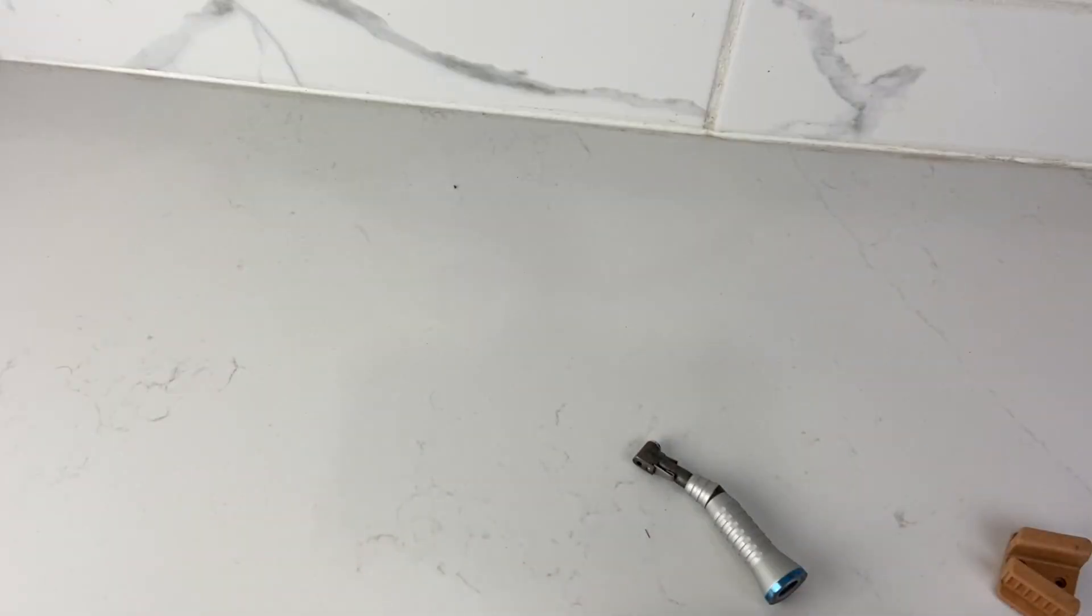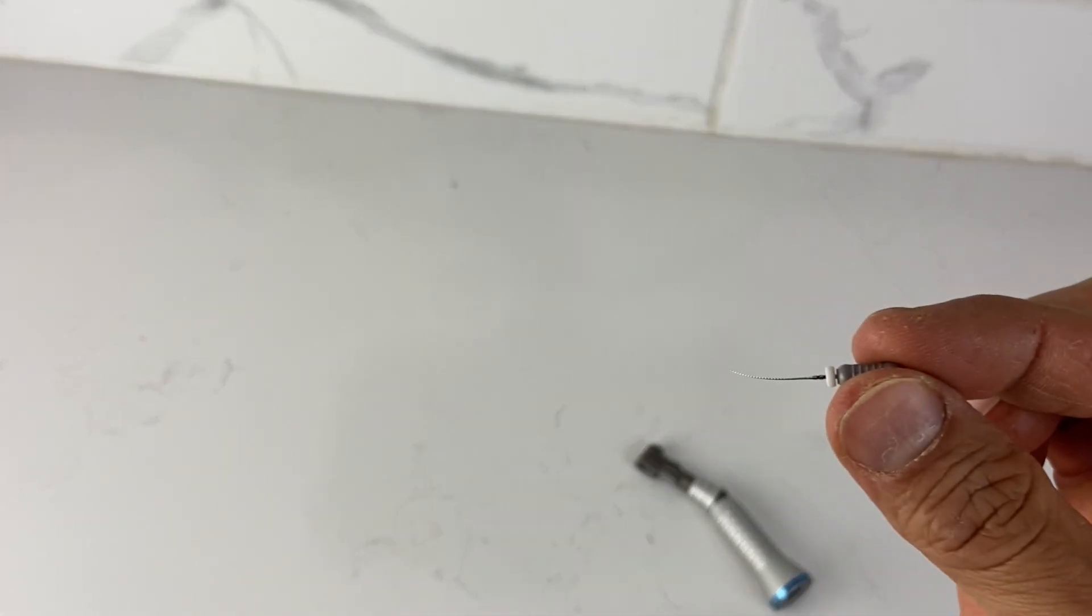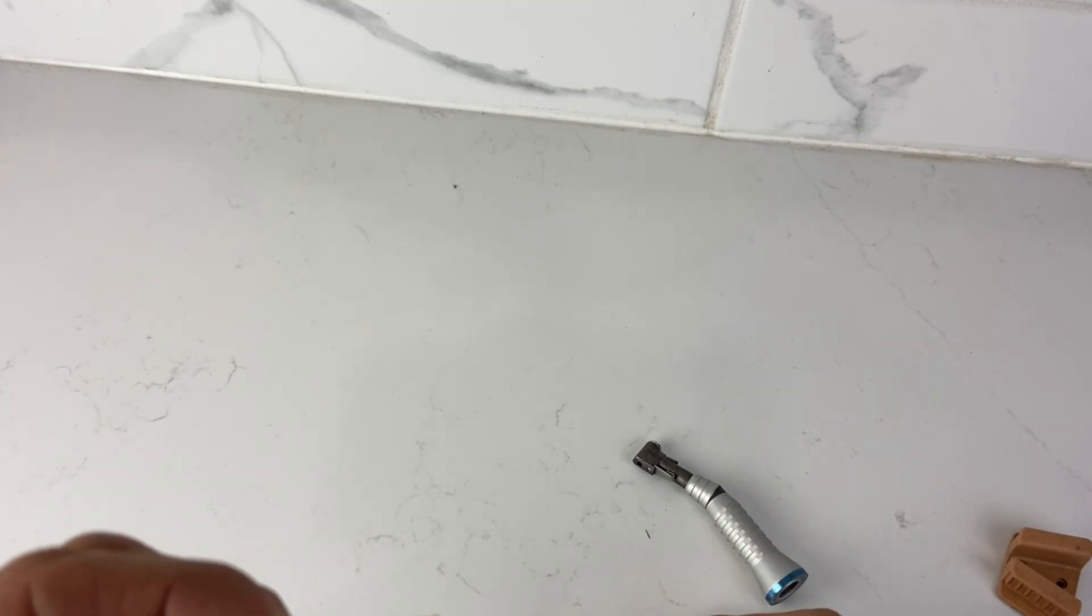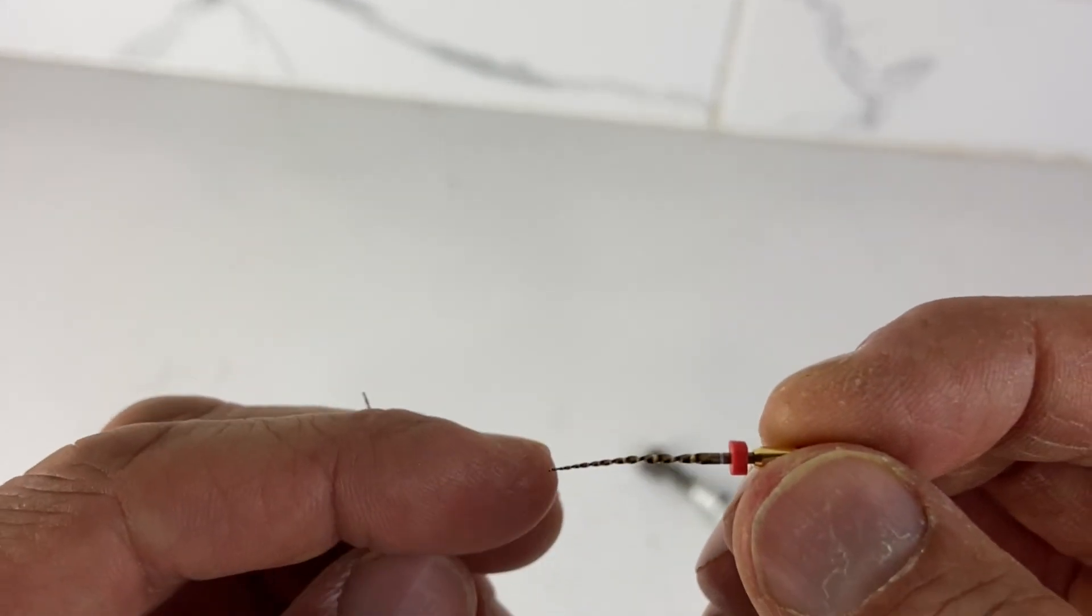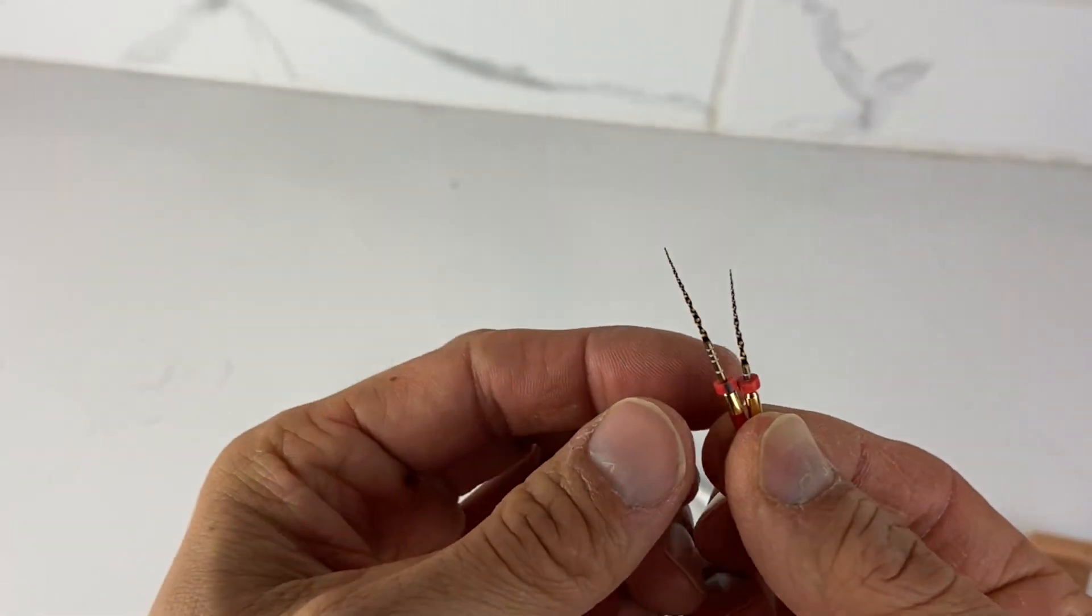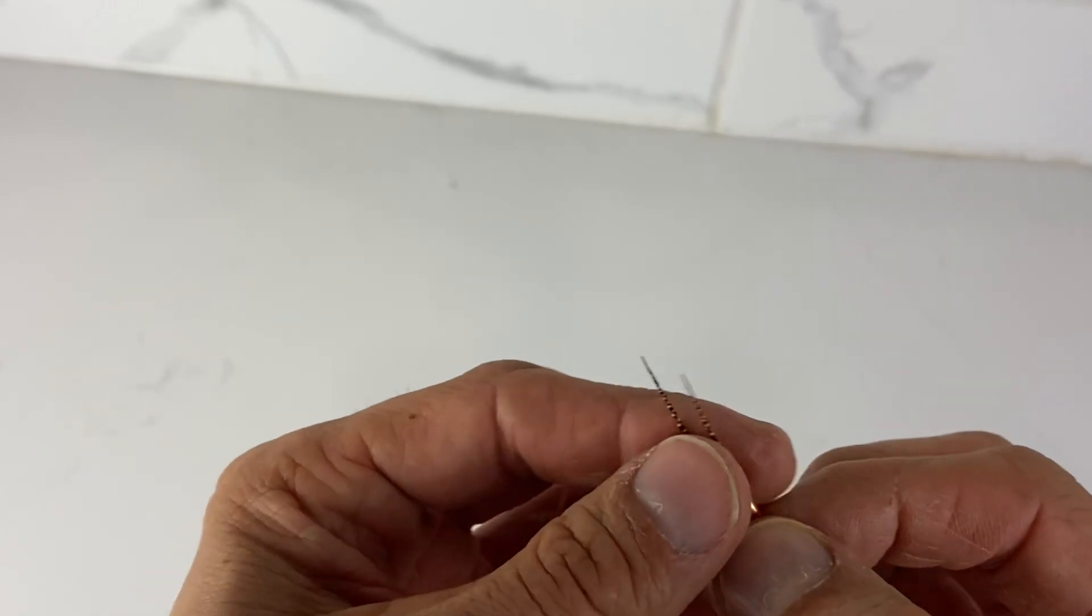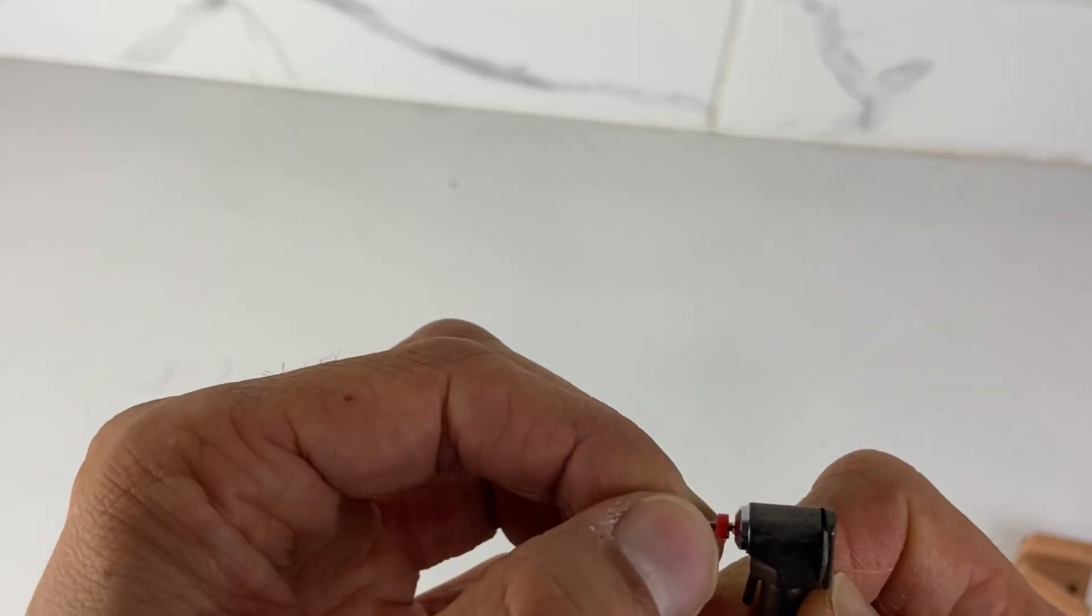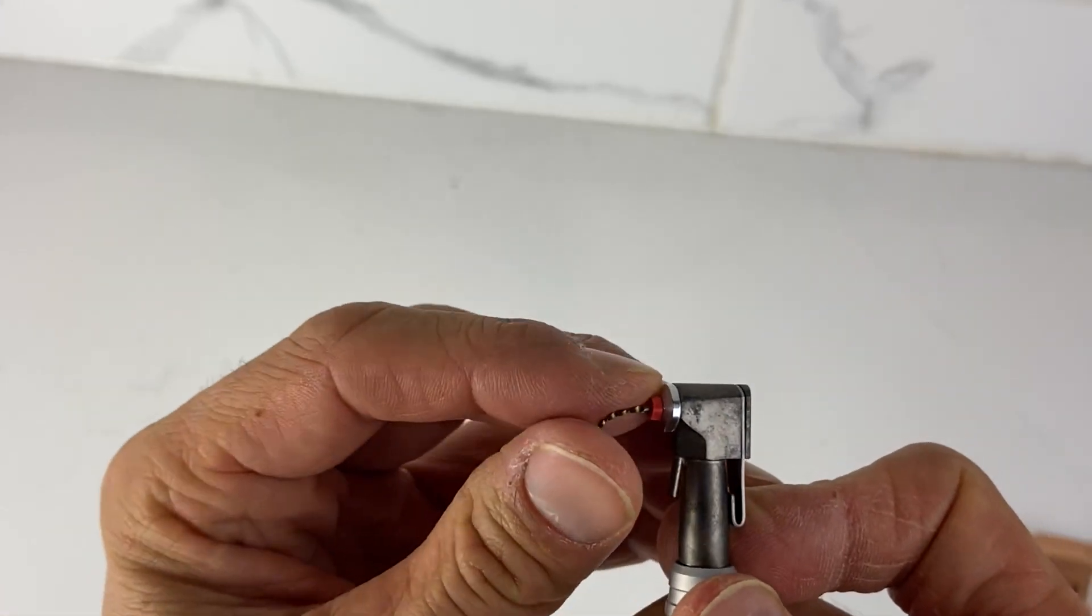So the next thing is 21 millimeter rotary files or reciprocating files, whatever you're using, that four millimeter makes a difference. And on these, this is a really old handpiece I found in the basement. So what I will do is I will bend the heck out of this. So I'll bend it like this, I'll get it kind of flexed. Then I'm going to take it with my finger and my thumb comes around.